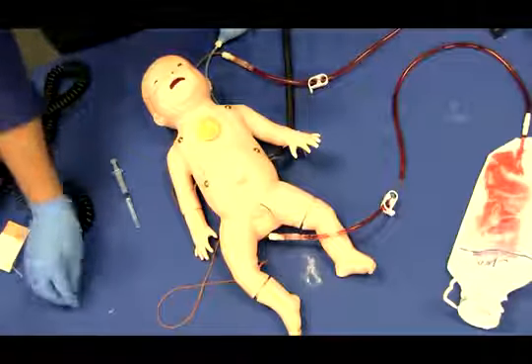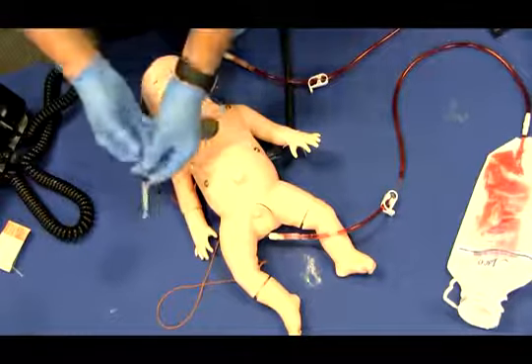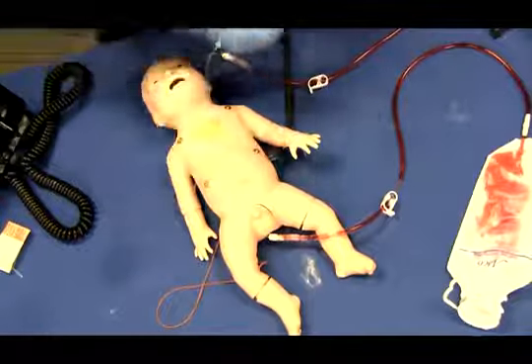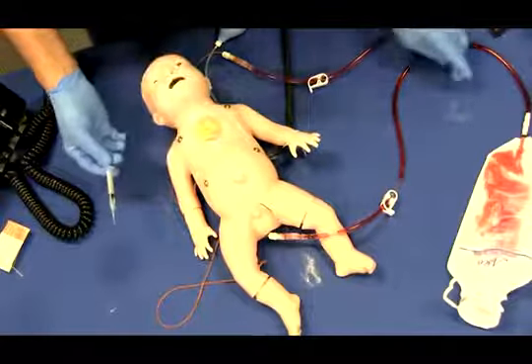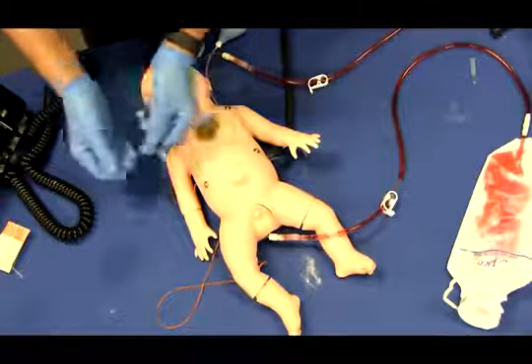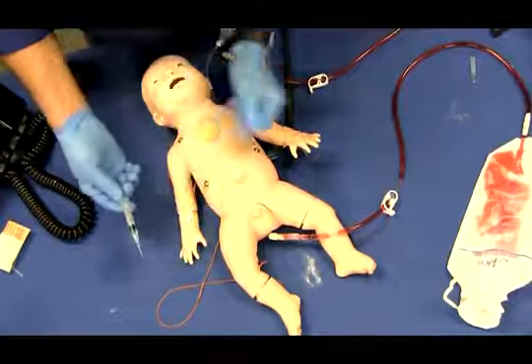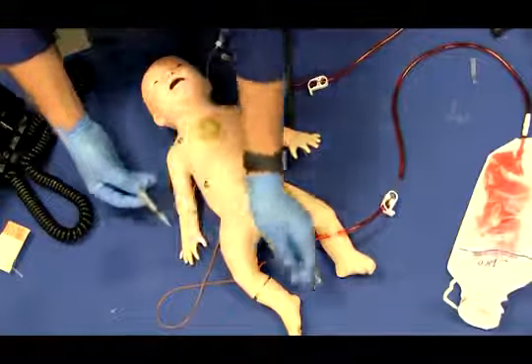Intravenous injections. Before practicing injections, follow included instructions for blood and bag setup. Use distilled water only to simulate cleansing the IV site and performing injections or withdrawals. Using any other fluids or harsh antiseptics is not recommended, as they could stain or cause damage to the simulator. Using the 25 gauge needle with syringe, follow institution guidelines to perform injections in the hand or foot.